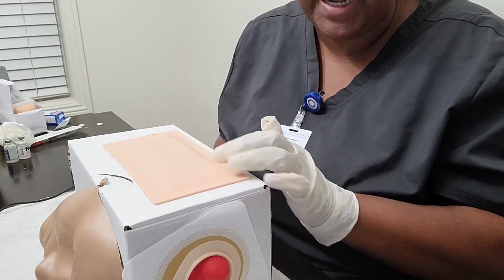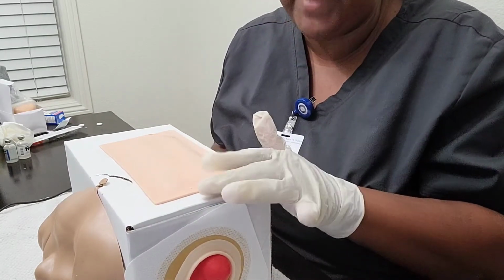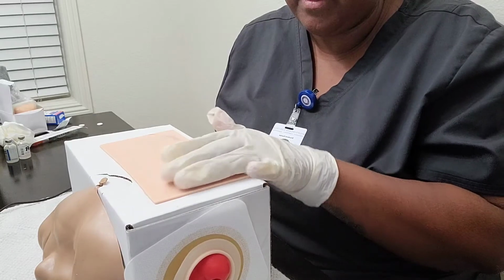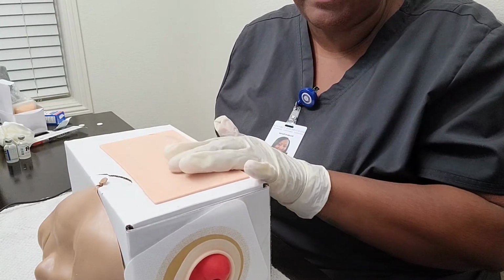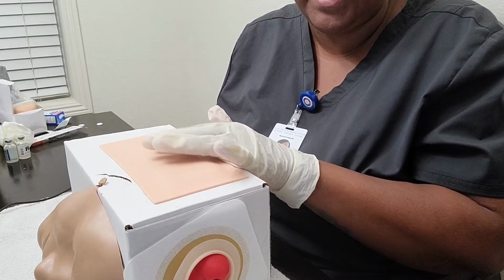Choose another site if I see any bruises or signs of infection. I will then palpate, and I will make sure I avoid the areas where there may be masses or tenderness.